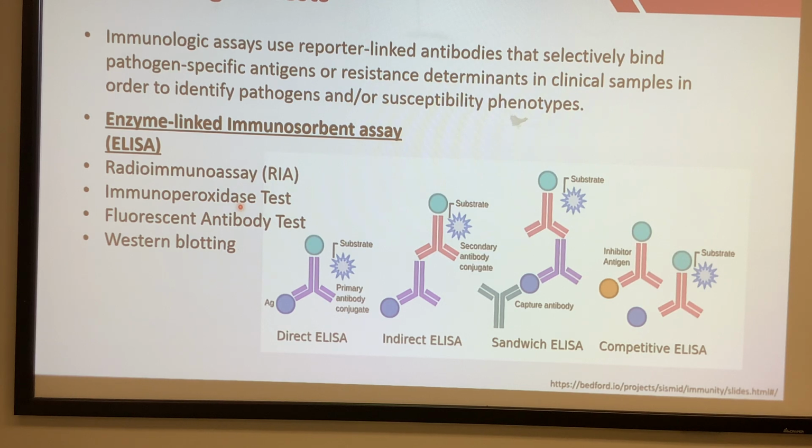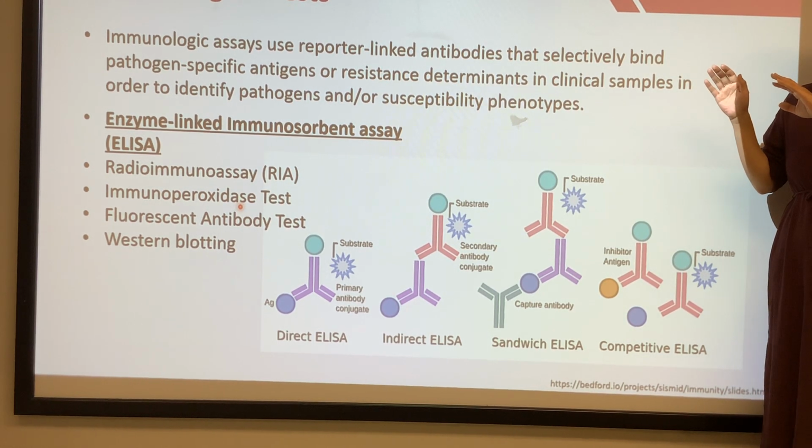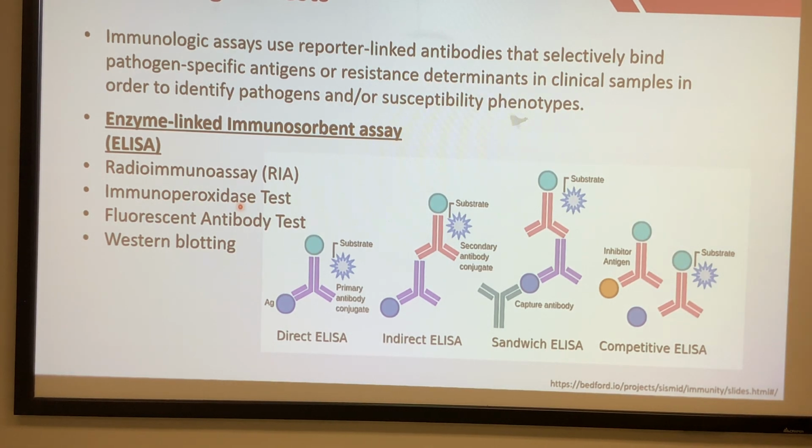The most important one I do want you to be very familiar with is the ELISA, and you better remember the name. You're going to hear it a lot. Enzyme-linked immunosorbent assay, and I gave you several examples here, so you might be able to understand it a little better. But anyway, it's a test between antigen and antibody, depending on your target. Okay, what am I testing? Then the manufacturer will make a commercialized counterpart to it, right? If I'm detecting your patient's antibody, then you're going to buy antigen from a commercial company, and those antigens will detect the antibody.